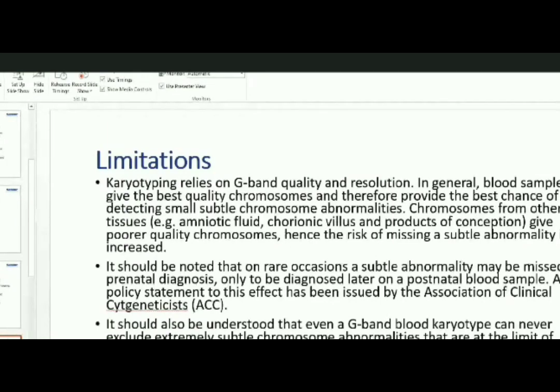Okay, in general, we'll have blood samples, and we'll be collecting the samples in a small sodium heparin vacuum tube. I had just mentioned, which I told you very clearly, that I only mentioned it in the limitations. There is nothing to do with this PPT actually. But anyway, I will just read a sentence so that you will have the knowledge.